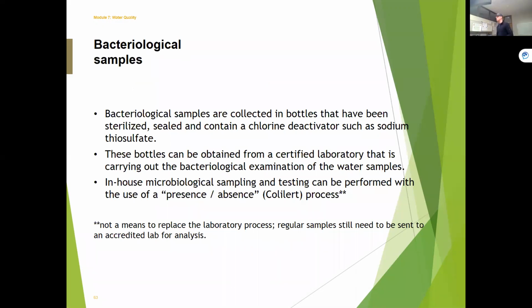Again, bacteriological samples are collected in bottles that have been sealed and sterilized, and they have a chlorine deactivator. If you can see here, you can see the powder at the bottom of this particular bottle. This is sodium thiosulfate. You also see it in the IDEXX bottles here. You can see those little crystals inside. Don't wash those out. Never ever rinse a bacteriological bottle.